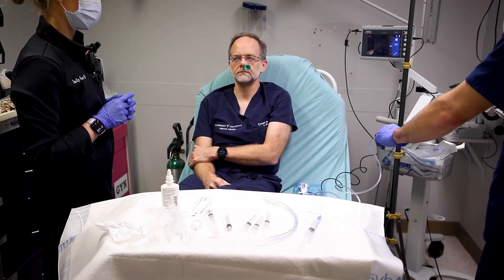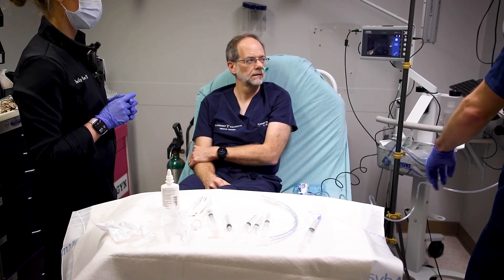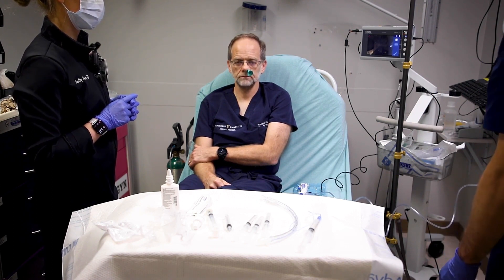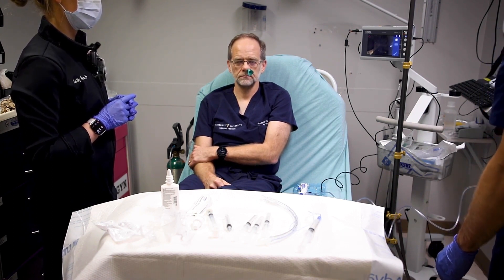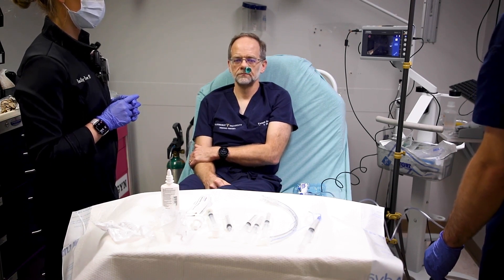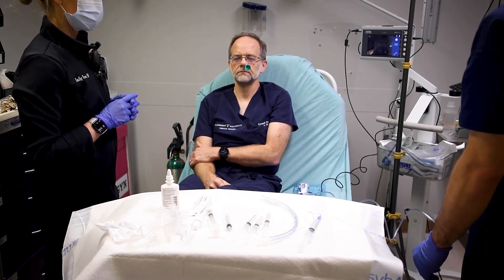We're going to get our scope prepared at this time by hooking up the port on the scope to oxygen, which we will run anywhere between two and four liters. This allows you to insufflate as you go down through the airway.